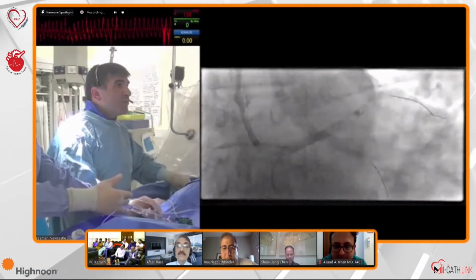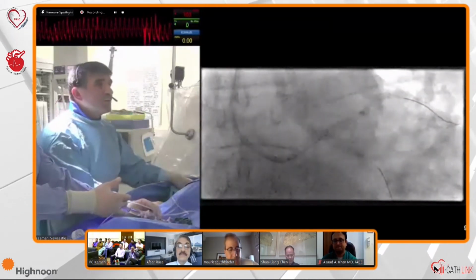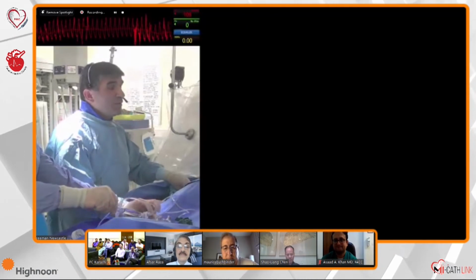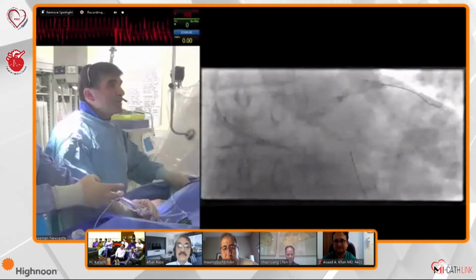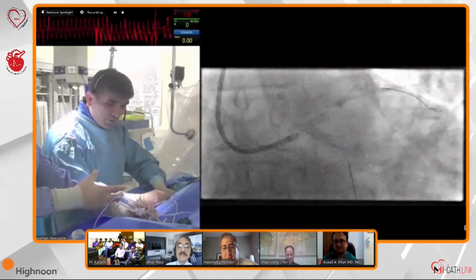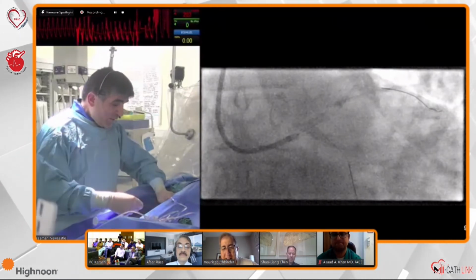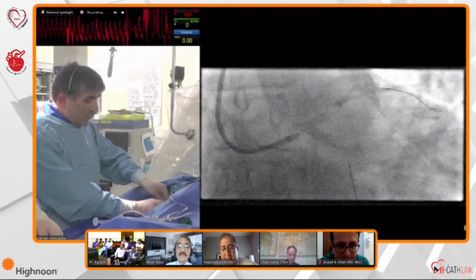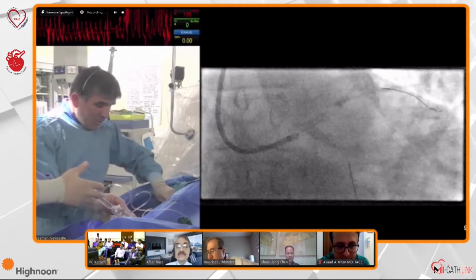And this is why, going back to the question I was asked earlier about the IVUS, when you go with 5.5 to 16 atmospheres or 6, I think you're not going to do any more, even if you see that the stent is probably not as expanded. So we'll do the IVUS run. This is my final. I'm going to take a picture for you so you don't have to do it, and do the IVUS, and that would be us done, luckily on time in a good way.